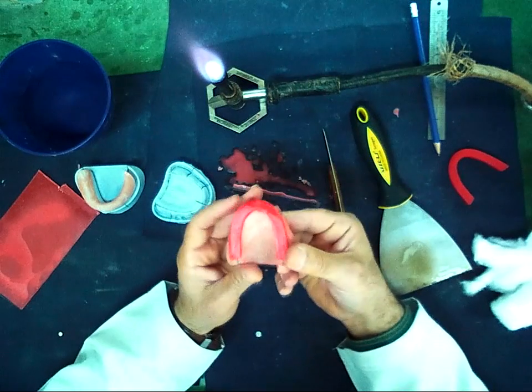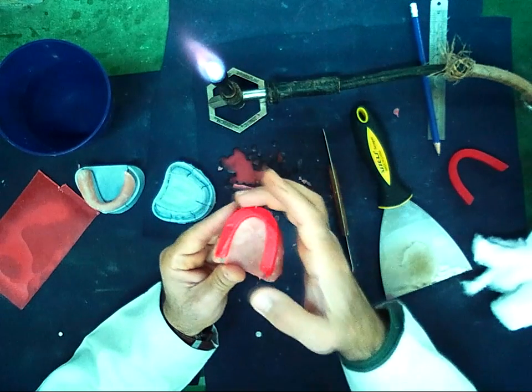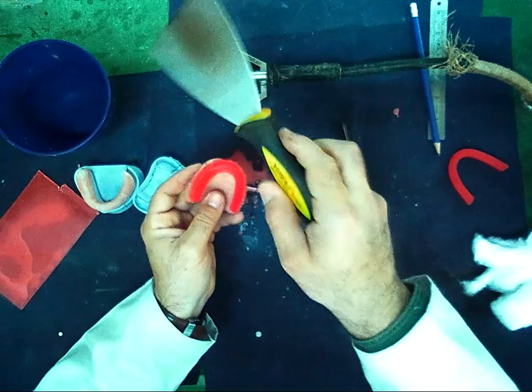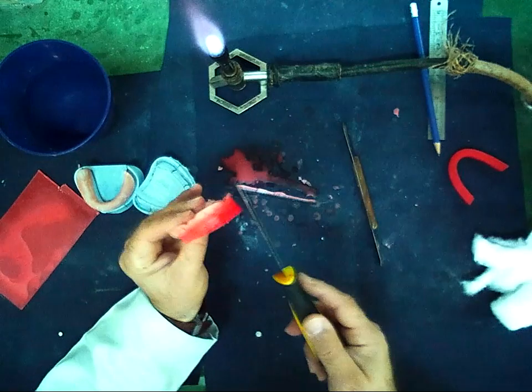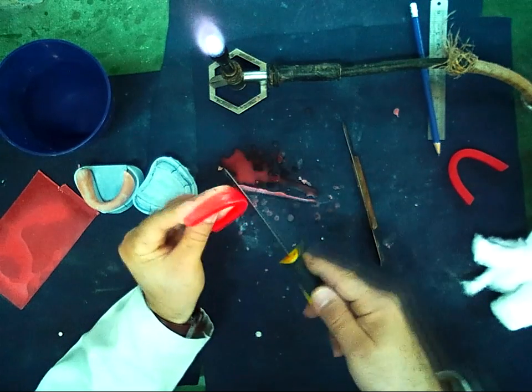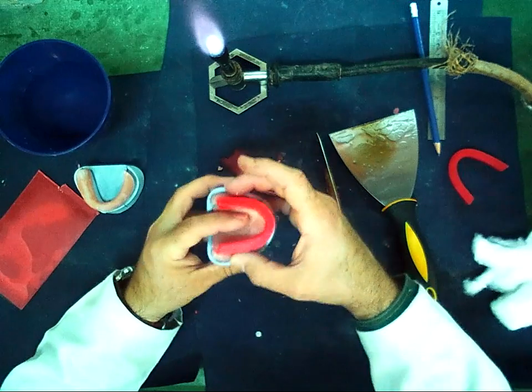The anterior part of the bite rim should be curved, and the posterior part is a straight line. When I remove from the anterior part, it should always be curved. Now I will check it again.